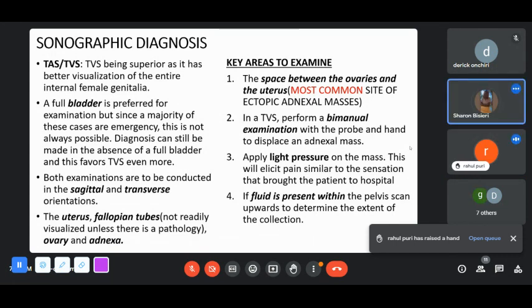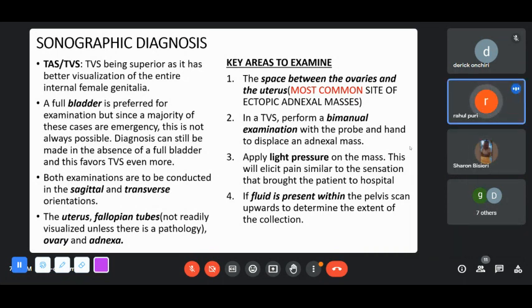Right. So with transabdominal, in fact, even the last time I was on call, there was a patient who was rather obese, and she came in for an obstetric scan, and unfortunately we couldn't really visualize the fetus well. We had to apply a bit of pressure, and I found that quite challenging. Even something simple like looking for the lie of the fetus took quite some work.